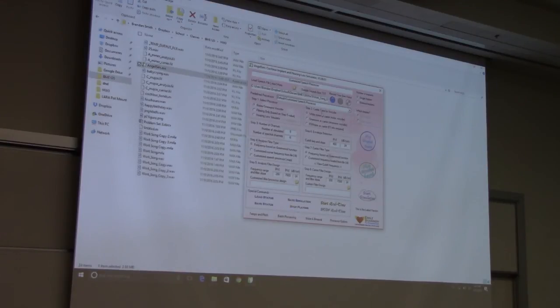Okay. So the goal of the PBL is going to be, how do you restore good musical hearing? The problem with these standard cochlear implants is the frequencies. You're basically breaking all the information in sound, which is this broad spectrum between 20 and 20,000 hertz, into a bunch of discrete chunks.